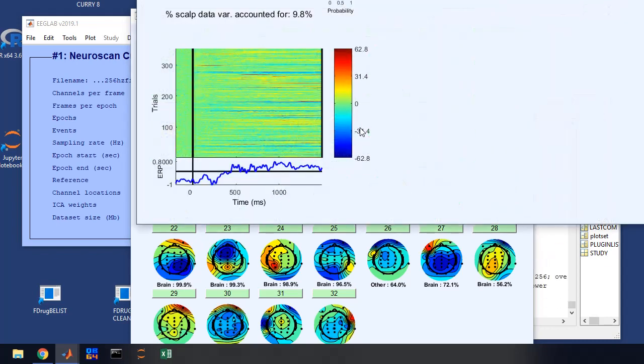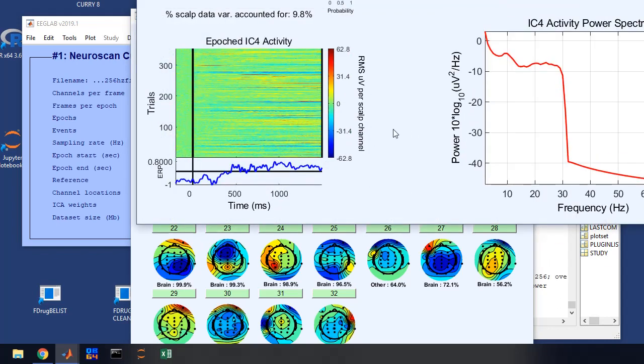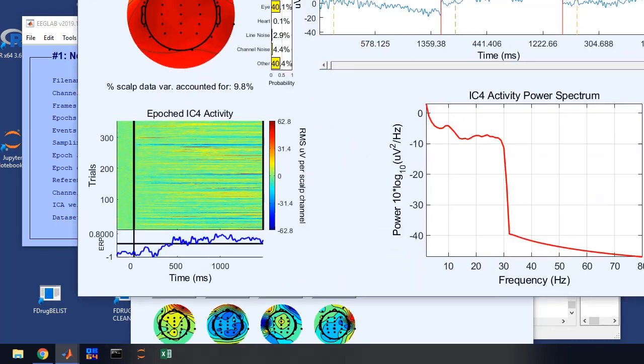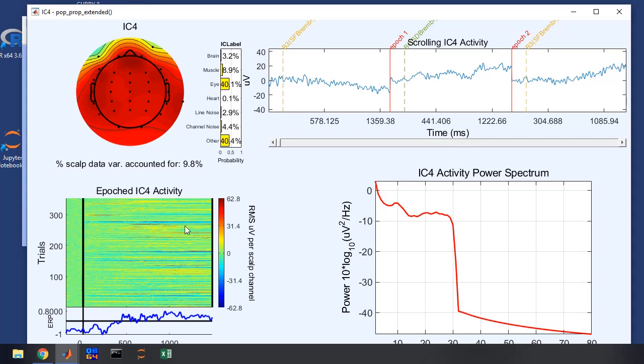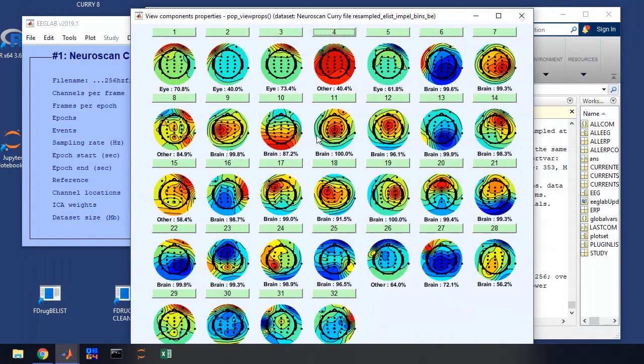Let's look at 4 and see what's going on here with 4. So you can see the distribution. You can see the power spectrum here. It's pretty low frequency kinds of things. And it's distributed all across all of our trials. So this plot down here plots the ERP for this component over time and then the power band. So if it's a redder color, there's greater power over time. It tells you where it's happening. So this is happening all over the place and across many trials. And IC label has it split between 40 and 40.